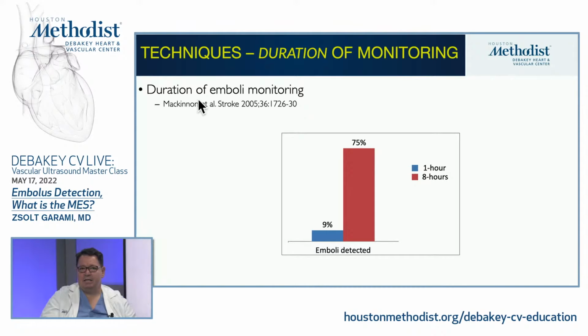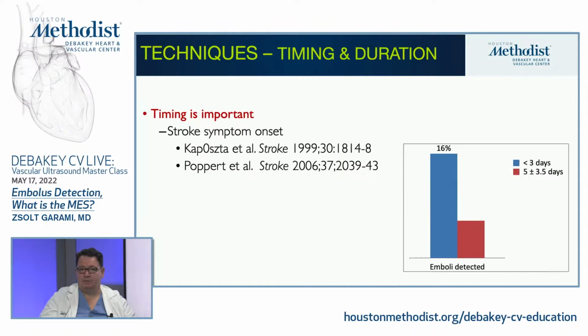So the take-home message is that the duration of monitoring for spontaneous emboli signatures is really important. These days, if you monitor for an hour, good. We probably need to extend it to monitor longer, so that you will see more incidents. Then we just need one of those Holter TCDs, and that will help us define exactly how many microembolus signatures are really out there.